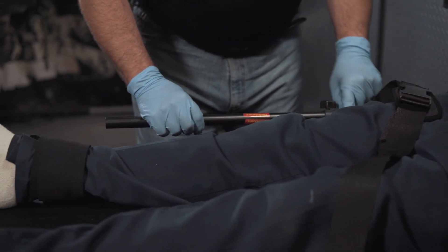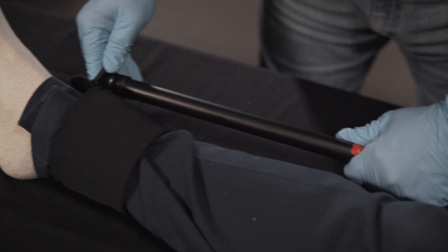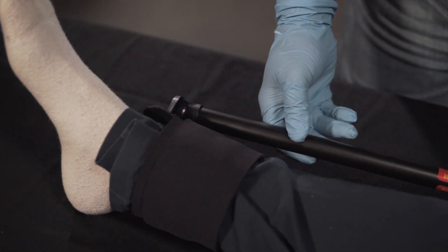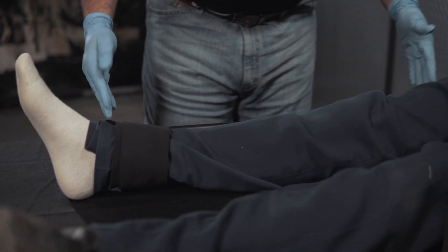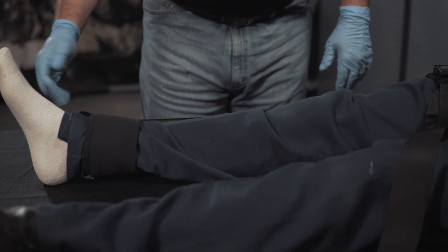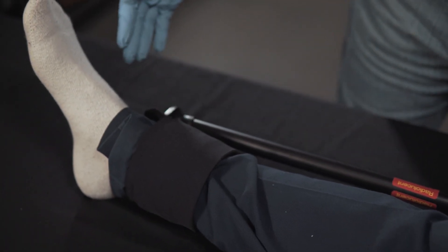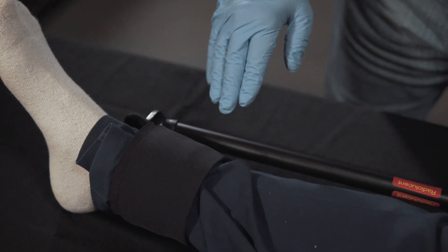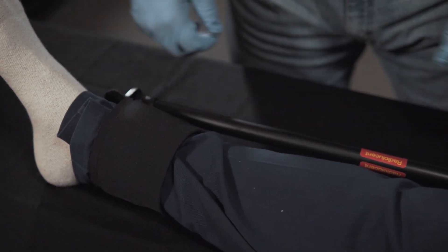Now we're going to take the rod, unscrew it, feed it down, and insert the end into the end cap holder. If you take a look, this device is for the most part in place and it is not extending past the foot, which has always historically been a problem with traction splints. This model achieves the traction from the hip versus the old models that used to pull from the ankle.